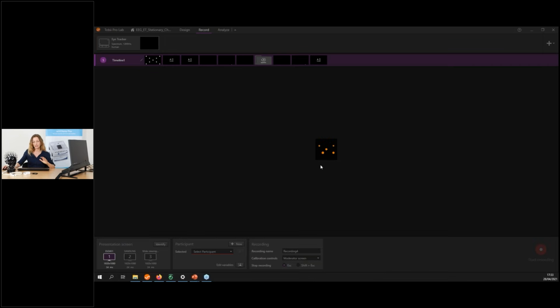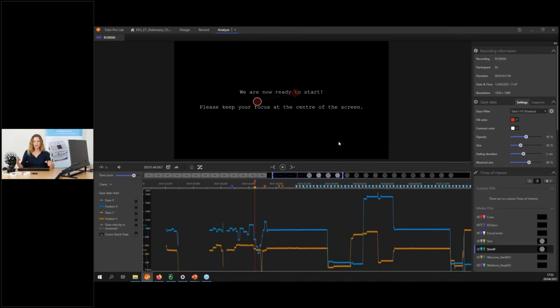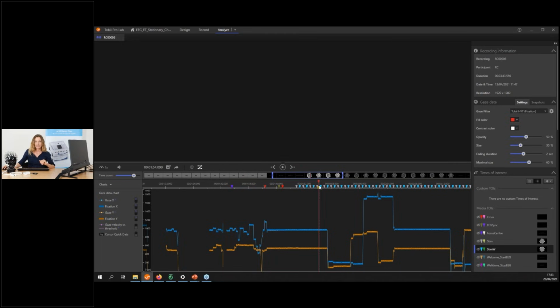This is also the data set that my colleague Michael is later on going to use. It's a bit of a longer data set containing more trials, but it's exactly the same task that we did just now. At the bottom is the timeline of the experiment. I can click through here. In the beginning, there are the instructions, and then come the different checkerboard stimuli. If I want to, I can replay what has been presented. Right now, it's a bit confused.